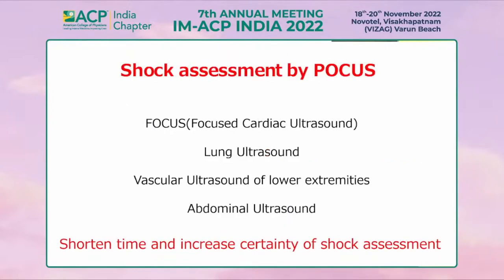When we do shock assessment by POCUS, we usually use the following four domains: FOCUS, lung ultrasound, vascular ultrasound of lower extremities, and abdominal ultrasound. We can shorten time and increase certainty of shock assessment by using POCUS.